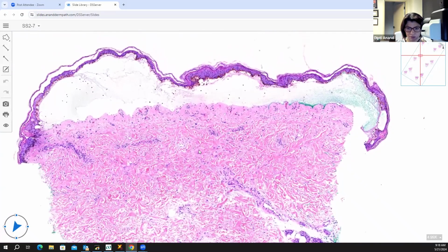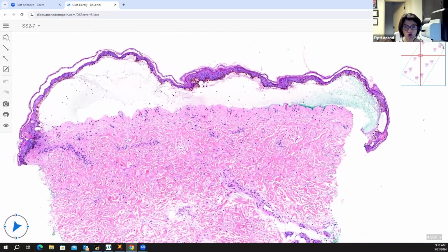And when you think about cell poor subepidermal blisters, you have to form a differential in your mind. Could this be DIF positive? This could be DIF negative. The DIF positive diseases would be EBA, porphyria, and pseudoporphyria. And the DIF negative diseases would be the inherited epidermolysis bullosa group of diseases, like dystrophic, junctional, all those inherited EB diseases, as well as bullous diabeticorum and the NSAID-induced cell poor subepidermal blisters.